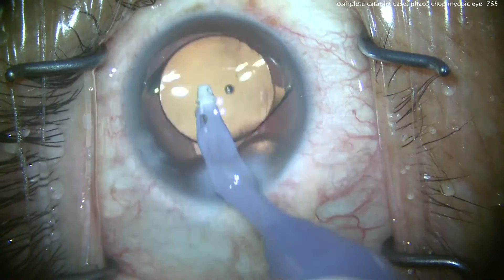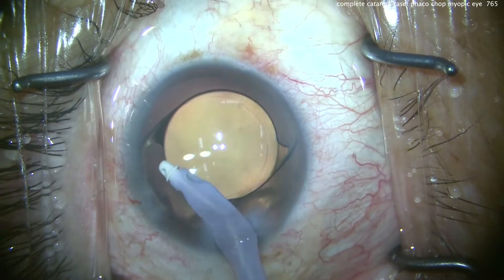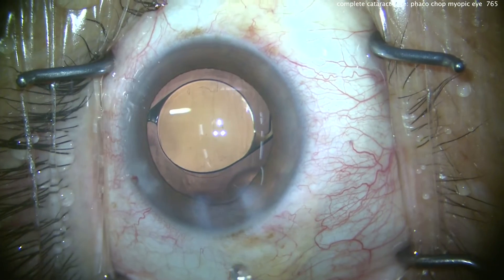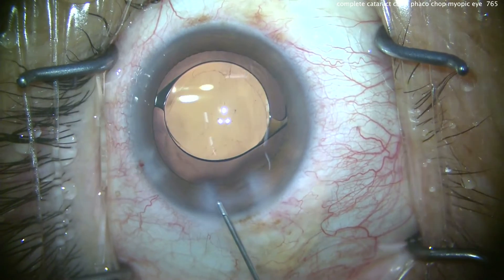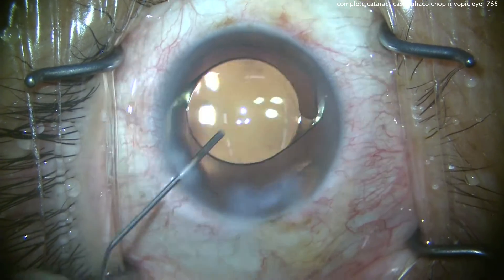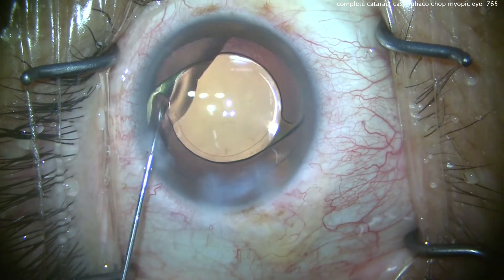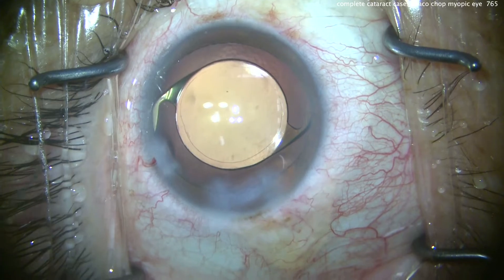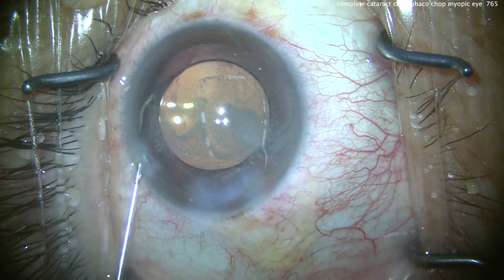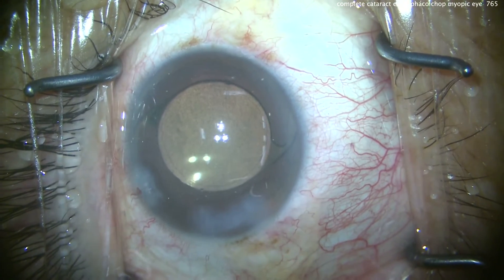Going behind the lens to remove viscoelastic — we're going to finish this case up pretty quickly. This is an unedited case, about five minutes or so. One more sweep here to make sure there's no retained viscoelastic, because these ultra-myopic eyes and even mildly myopic eyes are more likely to have IOP spikes. Let's make sure we get all the viscoelastic out. A little triamcinolone going in the eye at the end of the case, which is helpful for the patient. We also put in a little moxifloxacin to prevent endophthalmitis.